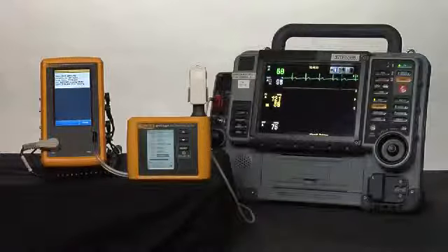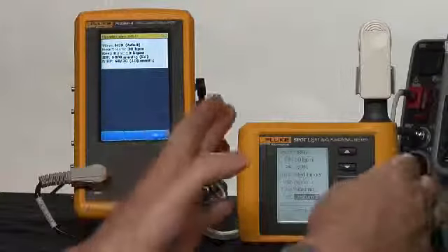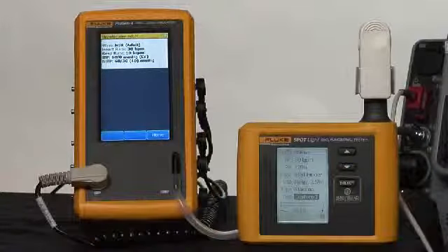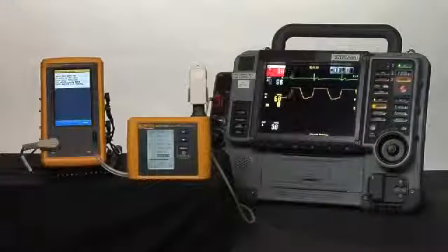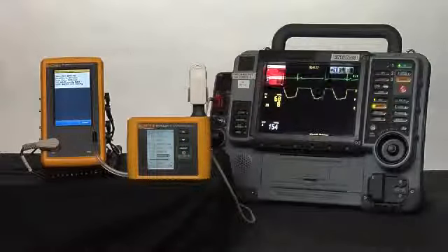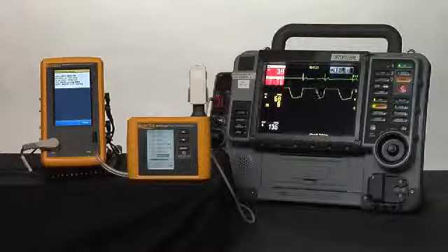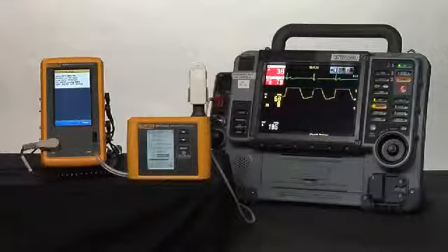We'll wait for our NIBP reading to complete. On the ProSim 4, we go back to the home screen, pick hypotensive. On SPOT Light, we'll switch to custom 1. Start another NIBP reading on the device. We now set off low alarm limits. And we're only waiting for the NIBP reading to complete. We can compare all the other values.